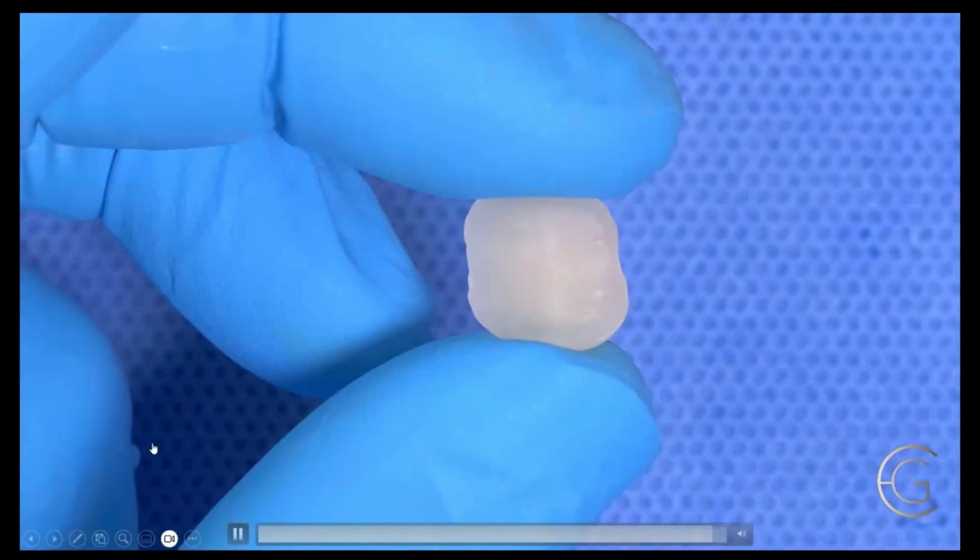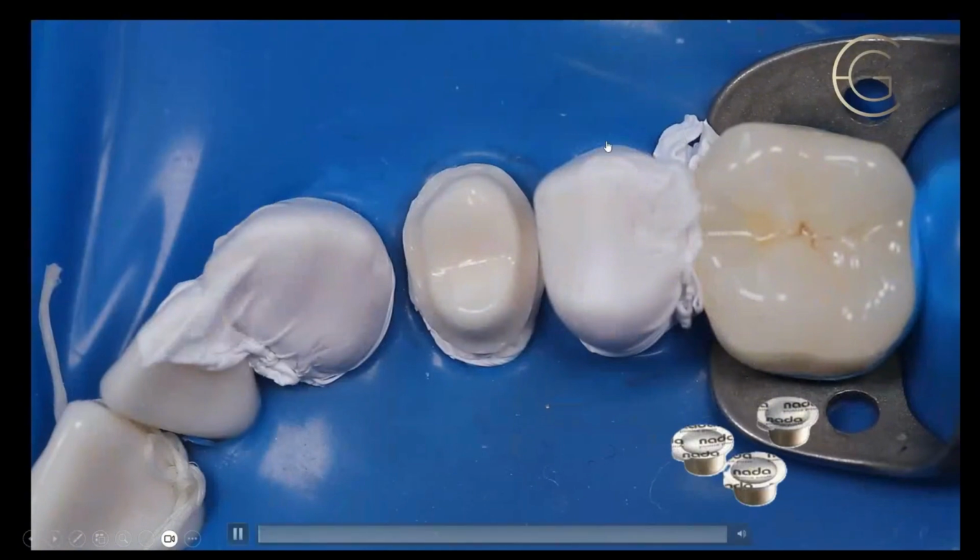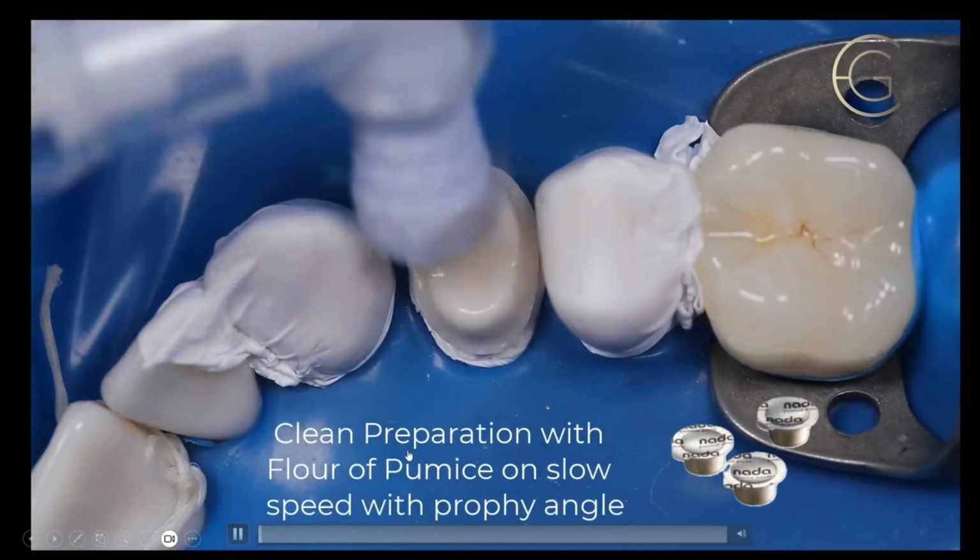That's the preparation for any type of zirconia, whether it be a veneer, an inlay, onlay, or a crown. Okay, I don't recommend inlays for zirconia, by the way. I just think there are better materials. Okay, so now we're going to go ahead and do this. This has to be a full crown.